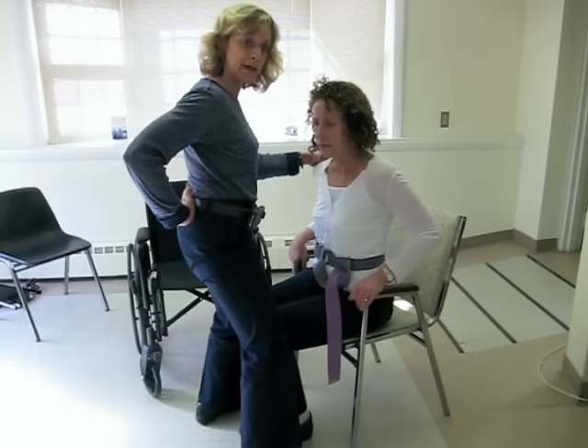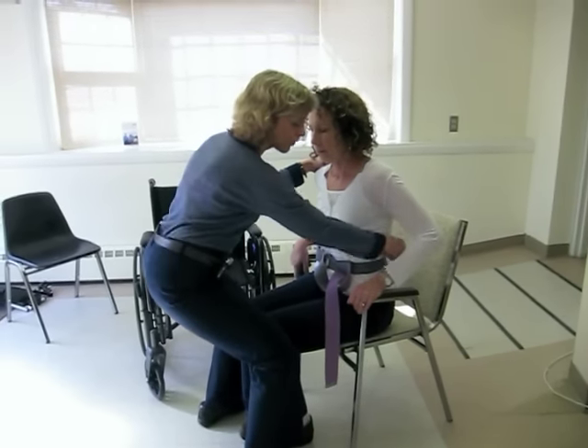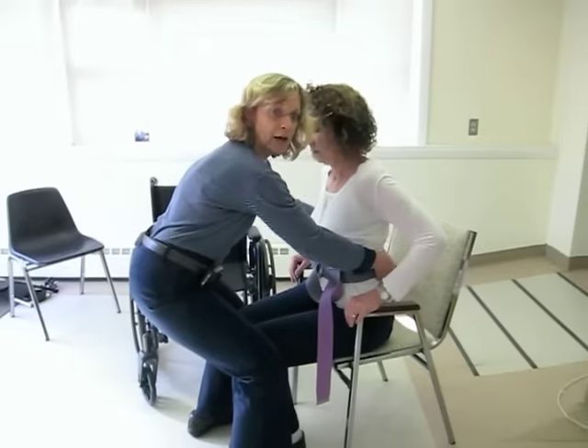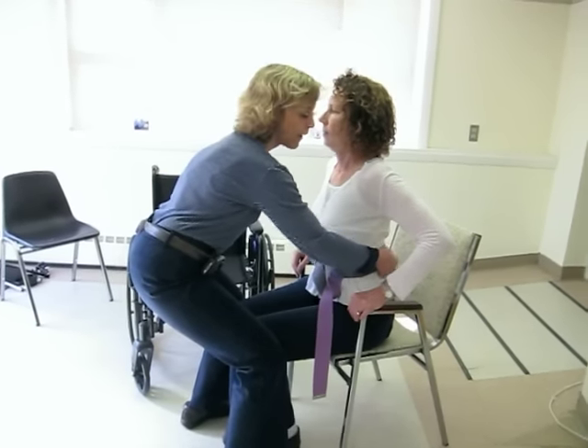Watch good body mechanics on your part — bend at the hips, maintain that low back curve, and grab behind the person onto the gait belt. Not under the arms, not in front. Come all the way back.